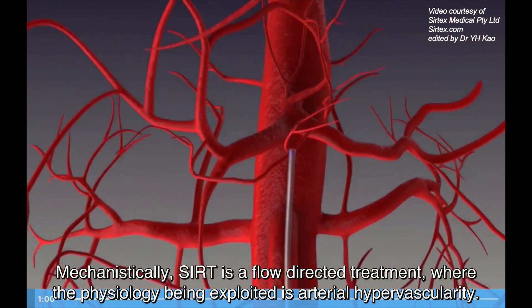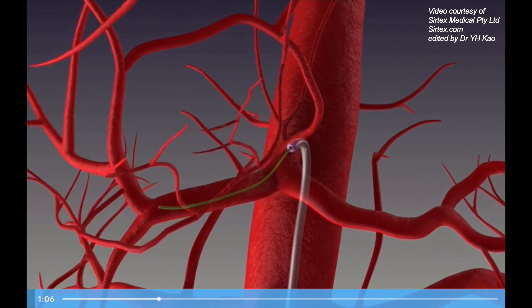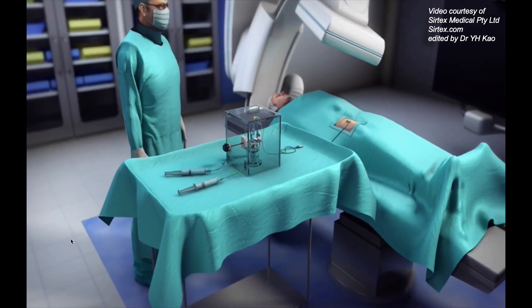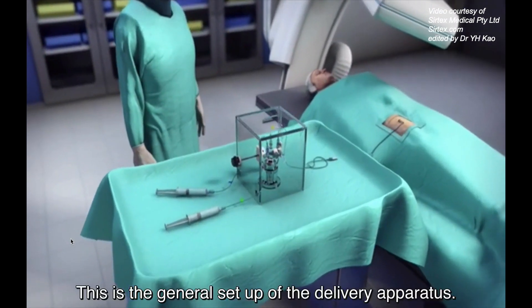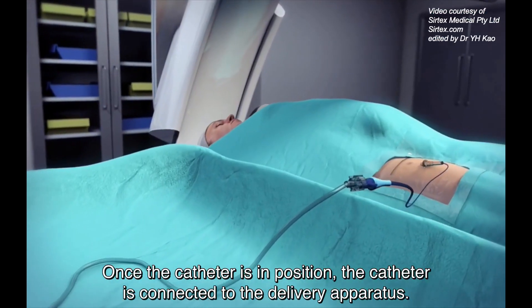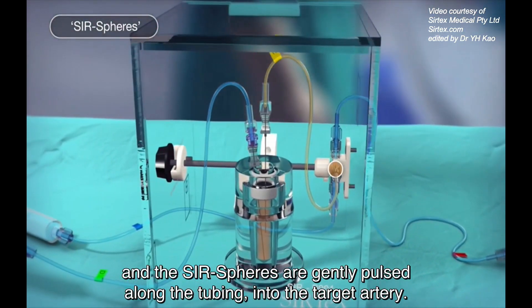Mechanistically, SIRT is a flow-directed treatment where the physiology being exploited is arterial hypervascularity. It requires an interventional radiologist to place an intra-arterial catheter in a suitable position. This is the general setup of the delivery apparatus. Once the catheter is in position, the catheter is connected to the delivery apparatus, and the SIR spheres are gently pulsed along the tubing into the target artery.